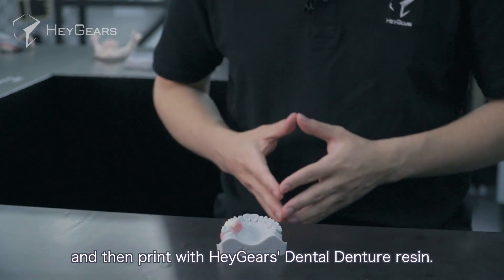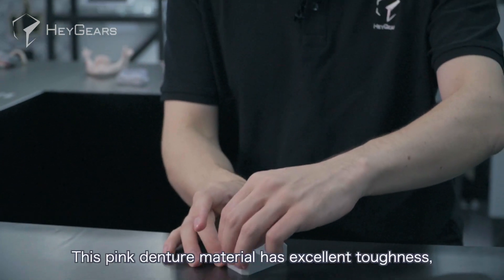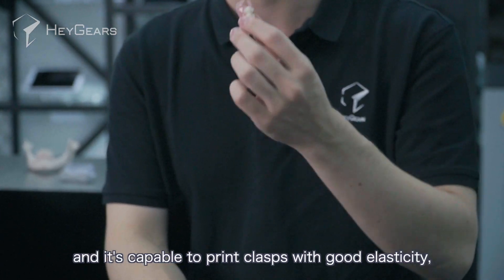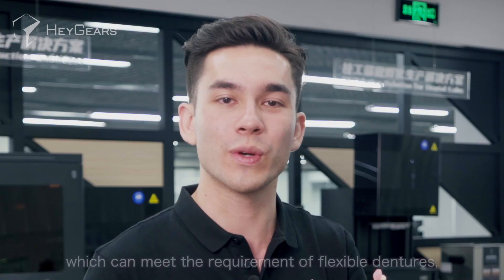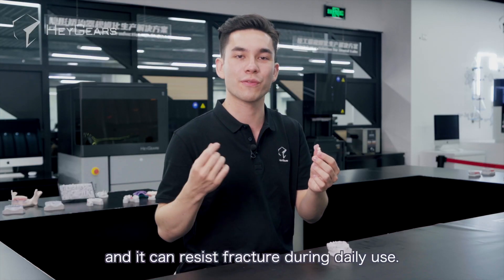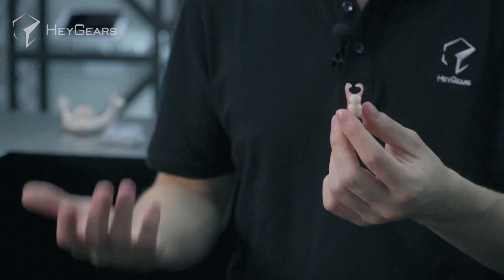With Haygears dental denture resin, this pink denture material has excellent toughness and is capable of printing clasps with good elasticity, which can meet the requirements of flexible dentures. It can resist fracture during daily use.